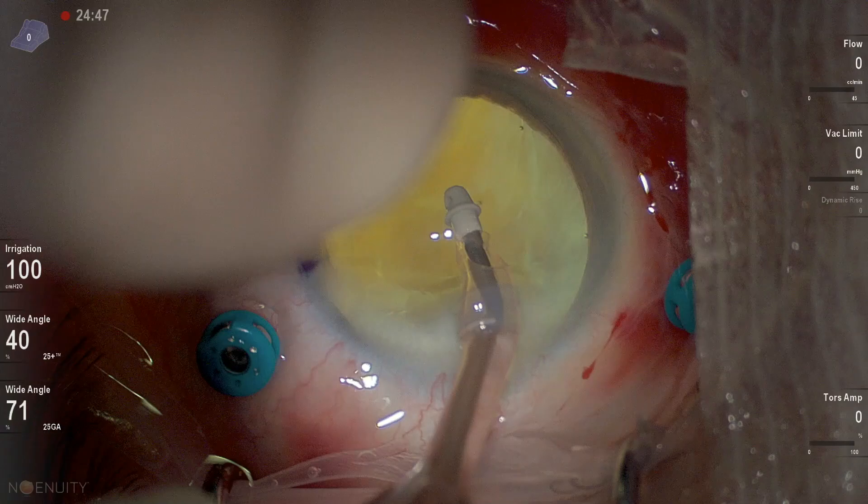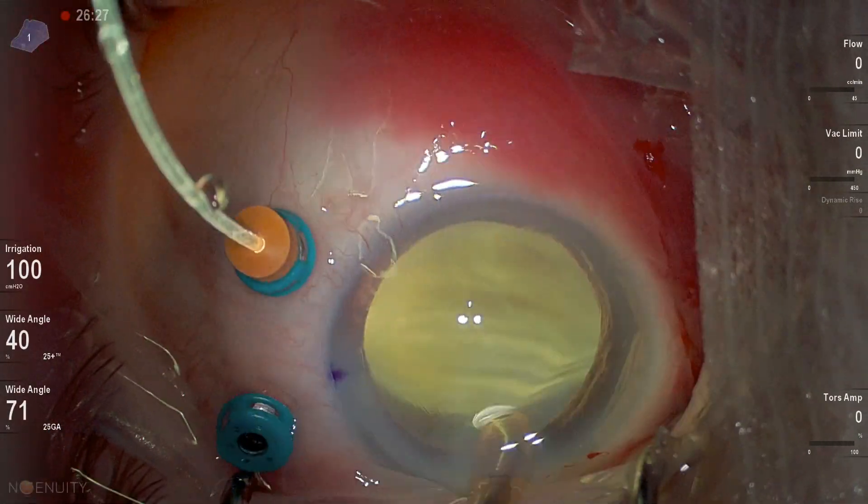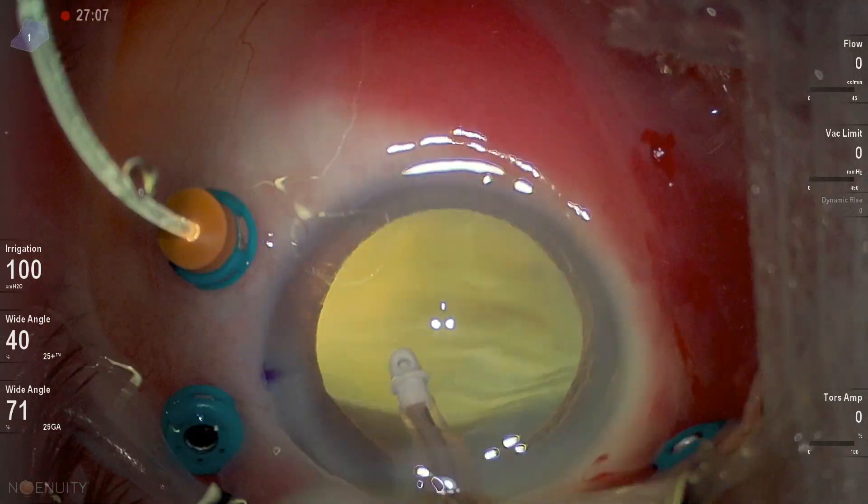As you'd expect, cortical removal was difficult, especially with the poor red reflex.